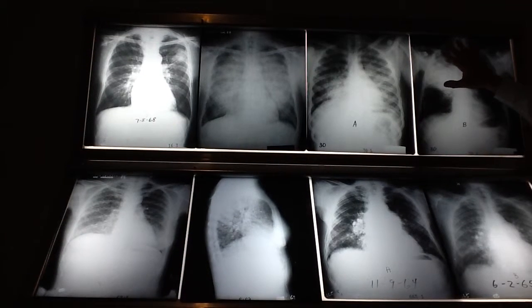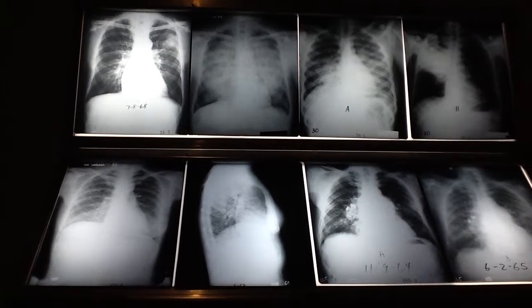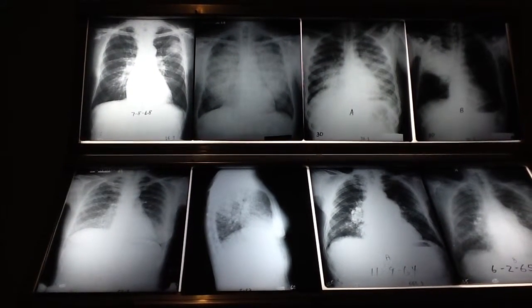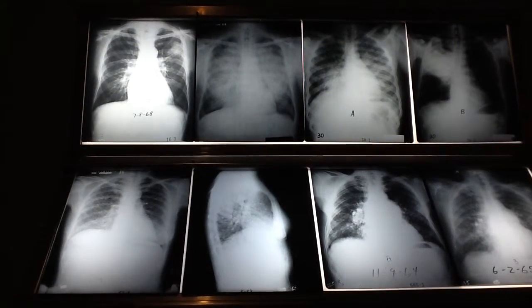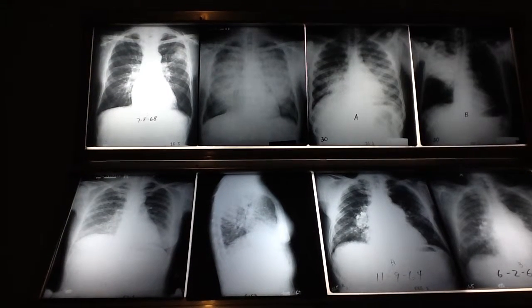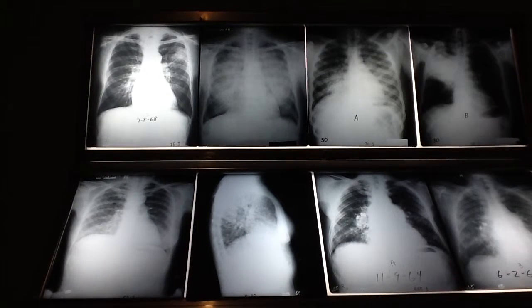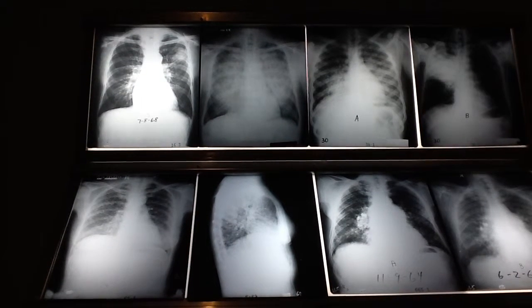Yes, I guess my question is, you can have it in 5, but there still be a heart border? It doesn't always silhouette the heart? Only if it touches in 5. Yeah, that's what I'm saying. Heart border, 5. That's not a silhouette. This is, but this isn't. I just thought that it always touched. No, it doesn't. Okay.